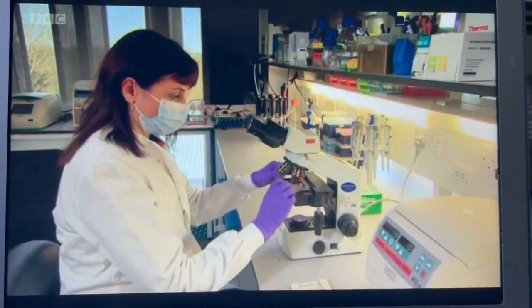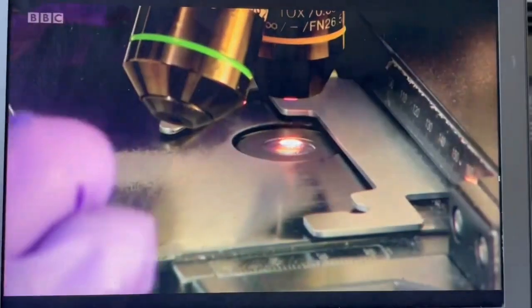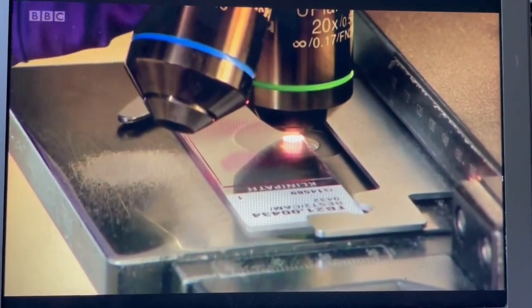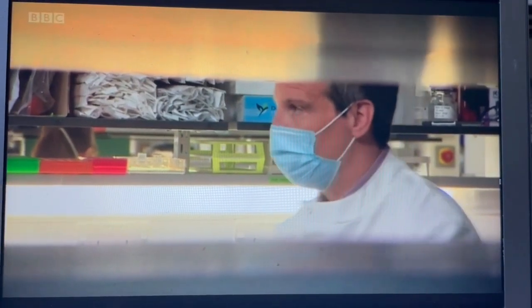Artificial intelligence is able to wade through scans, telling the difference between healthy cells like these and unhealthy cells that may lead to cancer. A human, a pathologist, then takes over. The whole process is 60% quicker, unblocking a bottleneck, so the potentially life-saving test can be given to thousands more patients. Some people might be a bit itchy about the idea of a computer checking their cells and not a person. How can you reassure them it's safe?